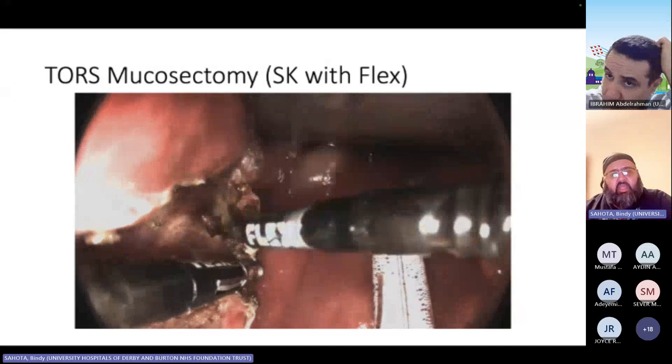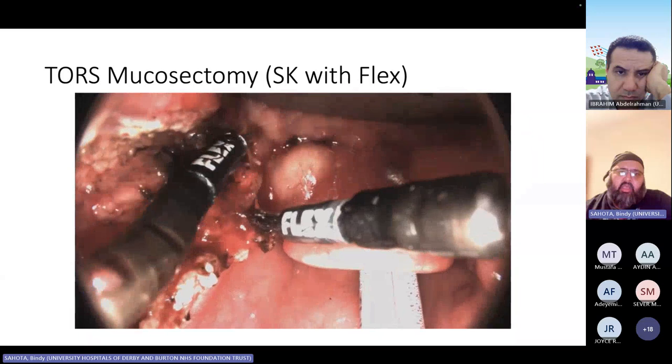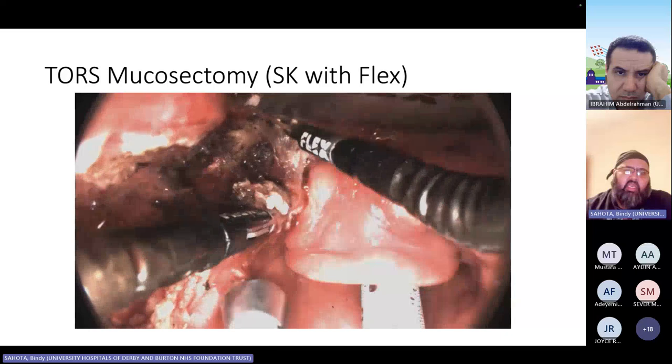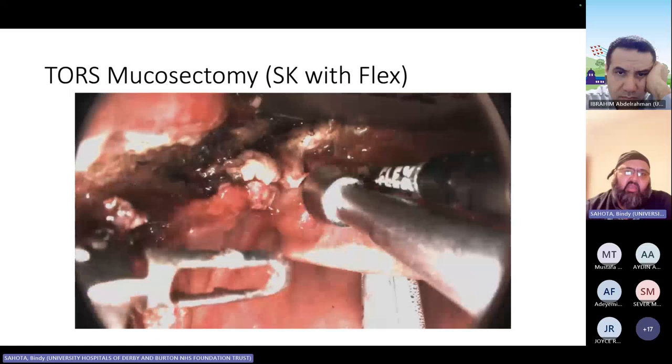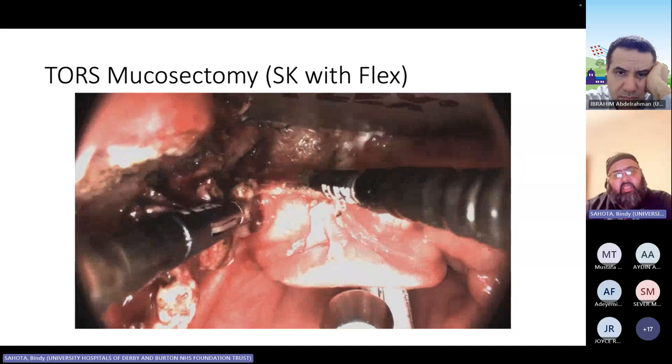Now, here you can take out the tonsil, keep all that mucosa intact, and you can clear the mucosa of basically the back of the tongue all out in a single unit. Here you can see these kind of cuts across. The way I kind of think about this is I often think of it like a book that's open. So I'm making basically cuts across the base of the book, across to the other side, and then I'll often delineate in the middle. And I'll often use this as the middle part of the book. And that's often where I'll cut down. And so you can see the resection that happens as a consequence of that.